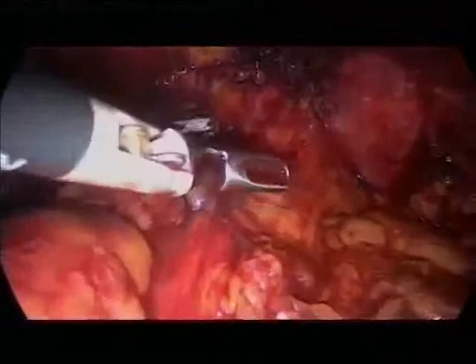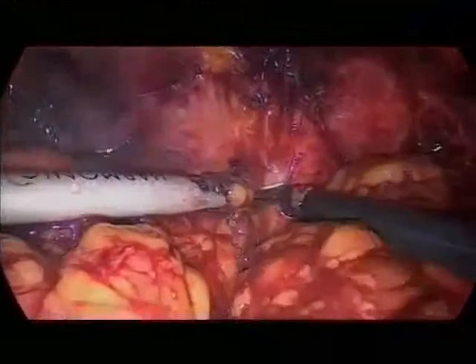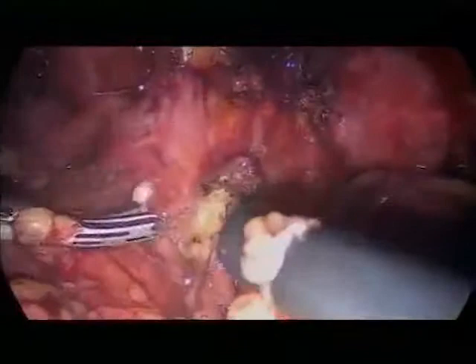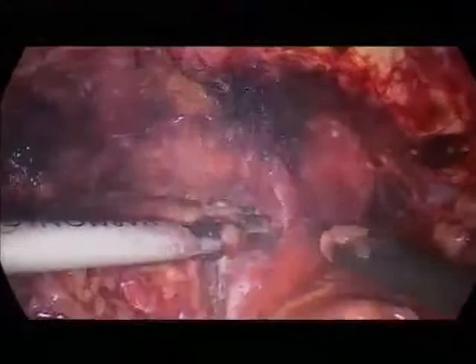So I'm using the Ultracision device. At home, I'm using the Sonosurge device, but only for the steps where we are really far from the nerves. As soon as we come closer to the nerves, we take the Sonosurge away and we use clips for the vessels. The patient is a little bit obese, you can see it.